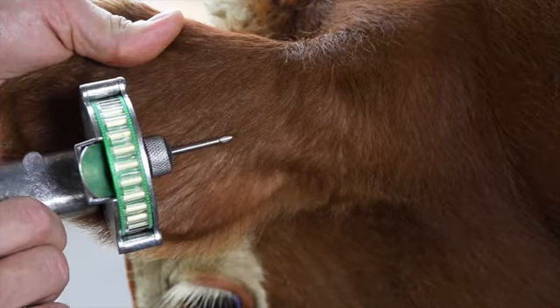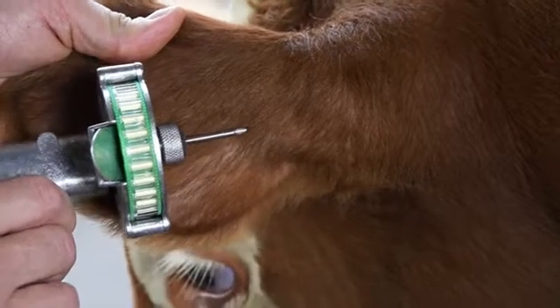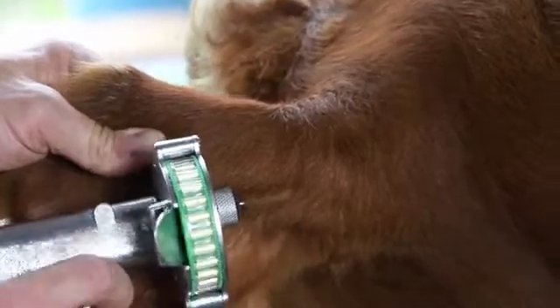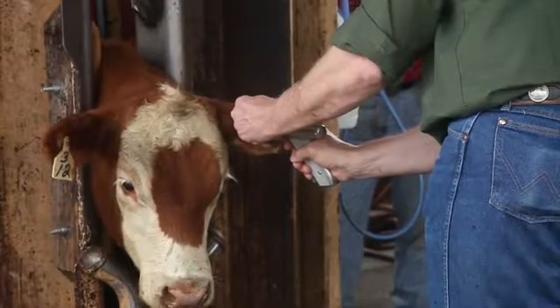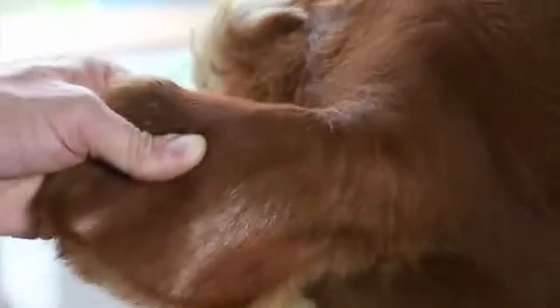Step 6. Take care to avoid injuring the major blood vessels or cartilage of the ear. Once the needle is fully inserted, squeeze the trigger of the Rall-O-Gun to deliver a full dose of Rall-Gro. Keep the trigger fully depressed until the implant needle has been removed from the ear to ensure that the implant remains properly deposited.